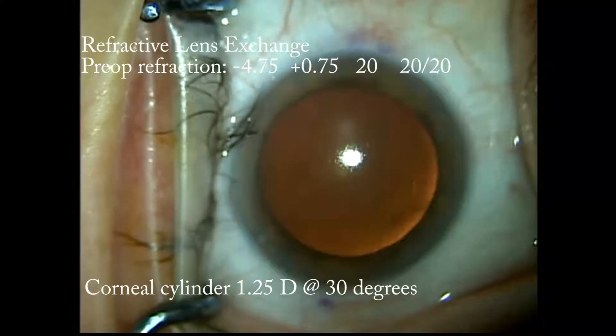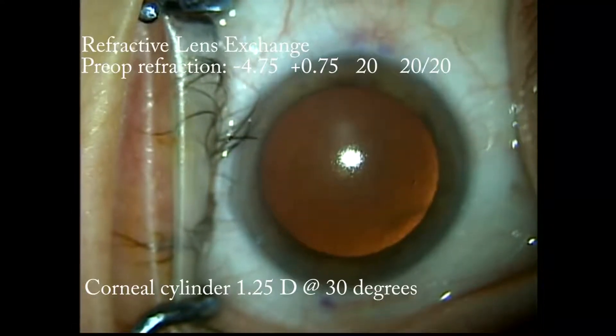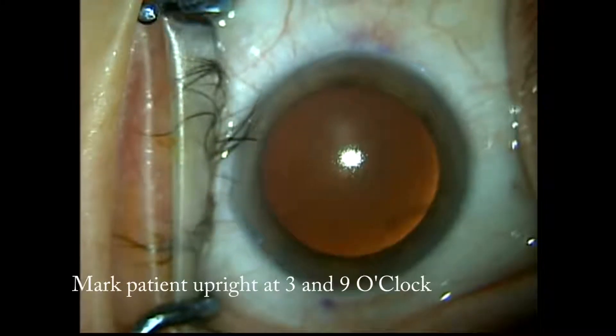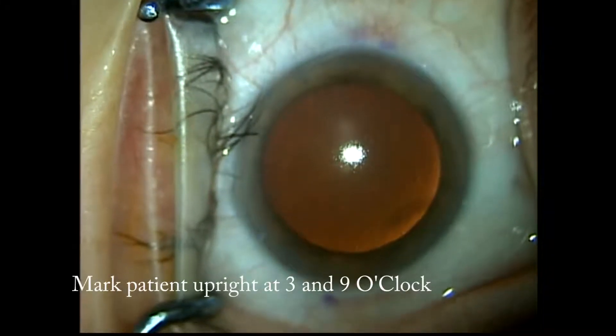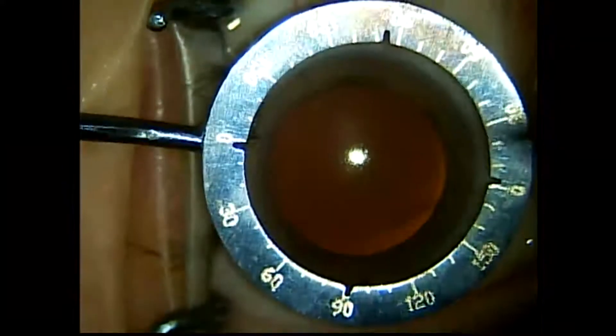This is a case of a refractive lens exchange with the crystal lens. The patient is a minus 4 myope with about one and a quarter diopters of astigmatism at axis 30.